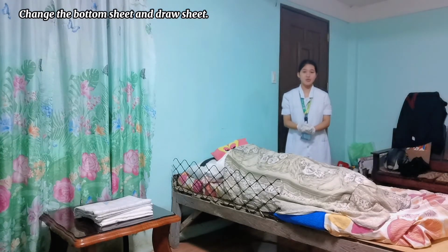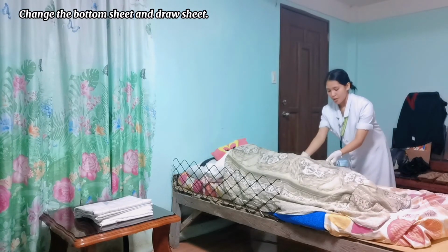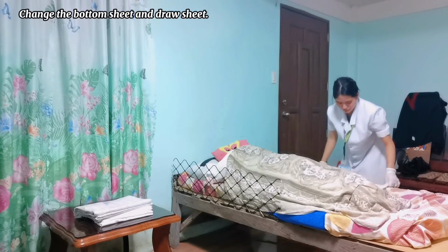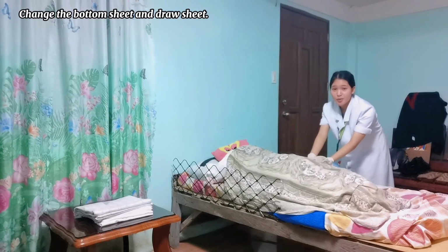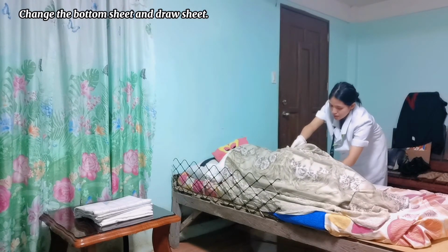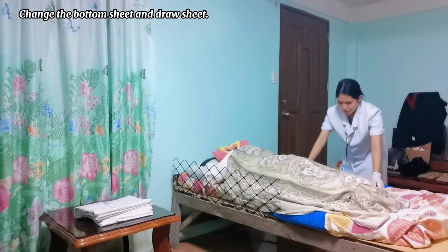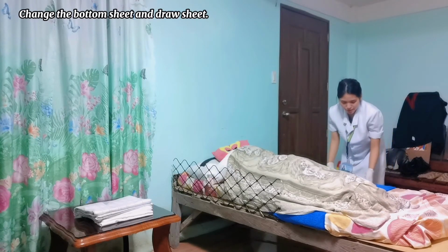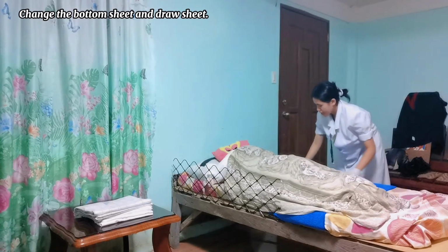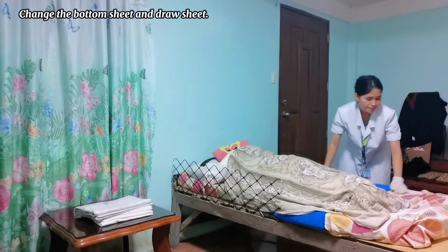And then after that we are also going to pull the rubber sheet. And then the next one is we are also going to pull the draw sheet, and also tuck it under the mattress. Make sure that the sheets are wrinkle free.